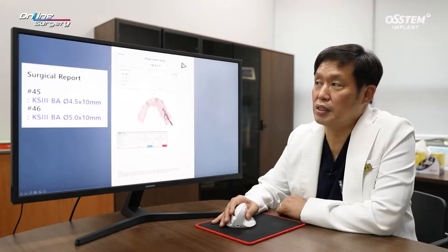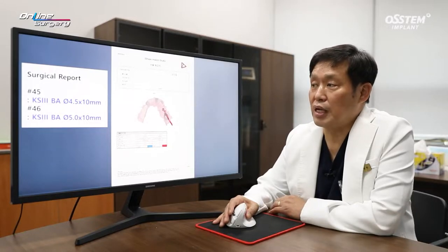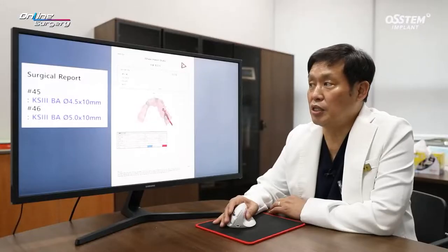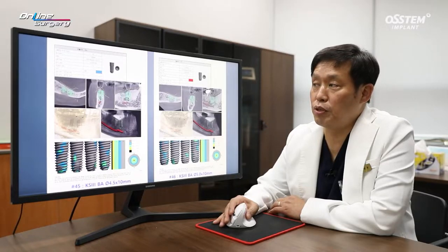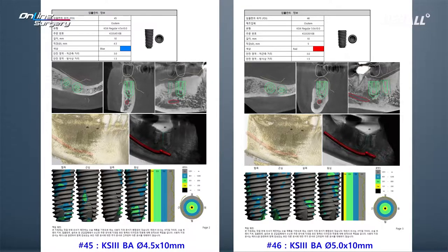The plan was formed after consulting with the OneGuide team. In number 45, KS3BA 4.5 by 10 mm and in number 46, KS3BA 5.0 by 10 mm implants were planned. The reason for 10 mm instead of 8.5 is because socket preservation was done and I wanted the implants to be in contact with the host bone, and there was sufficient distance from the inferior alveolar nerve.